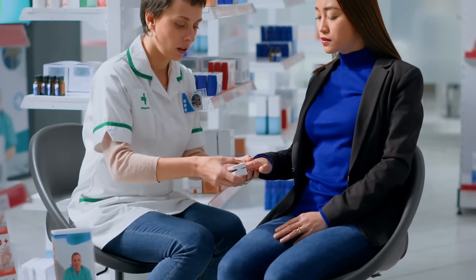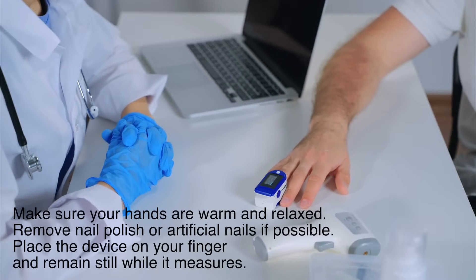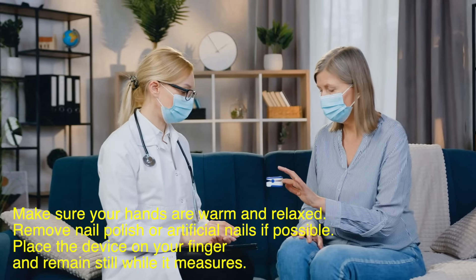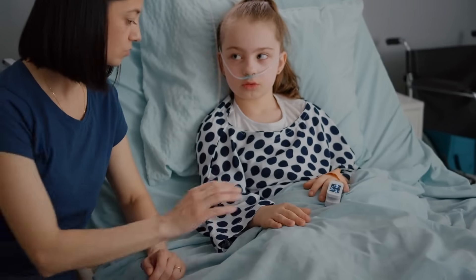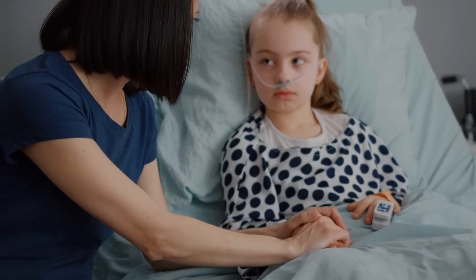Using a pulse oximeter is simple, but getting an accurate reading requires a few precautions. First, make sure your hands are warm and relaxed. Remove nail polish or artificial nails if possible, as they can interfere with the light. Place the device on your finger and remain still while it measures — readings typically stabilize within a few seconds. It's important to remember that pulse oximeters provide a snapshot of your oxygen levels. If you're concerned about your readings or symptoms, always consult a healthcare professional for a comprehensive evaluation.